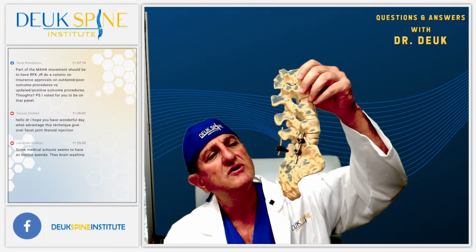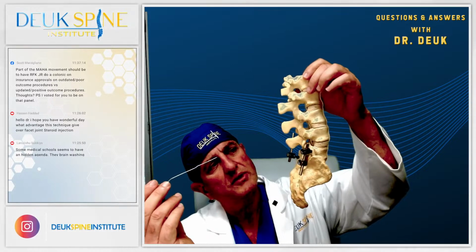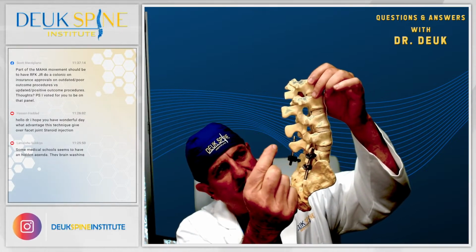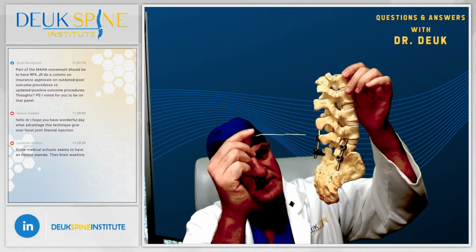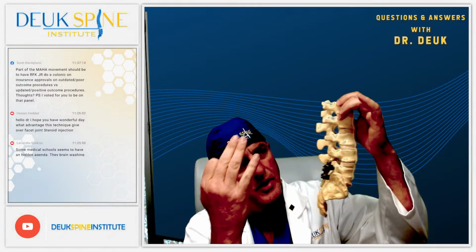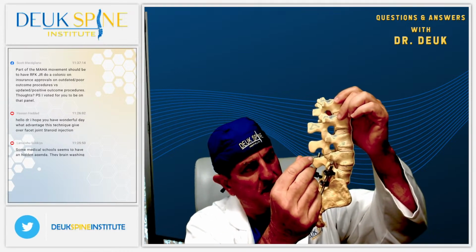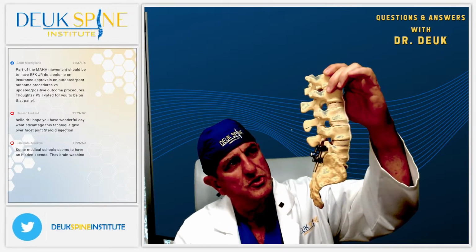So we went what's called transforaminal. Forget about the metal. This is one of our spine models. I came from the back side and I went through the hole that's already here right into the herniation. So the only damage being done is a cut on the skin. Everything else underneath the skin is being spread gently and spread apart, and then it comes back together like an elastic band when we're done. And then we enter the herniation right here. So that's really what we're doing, okay?